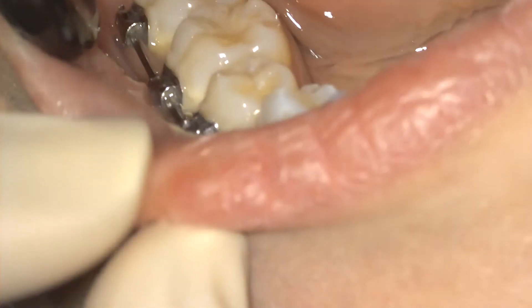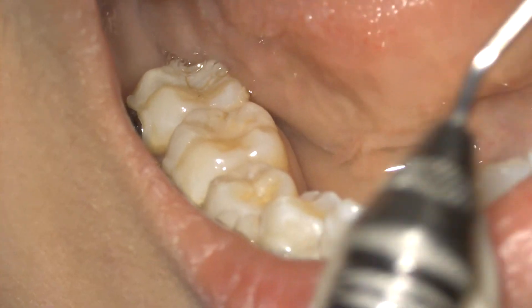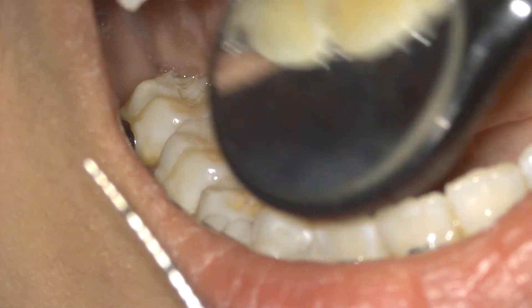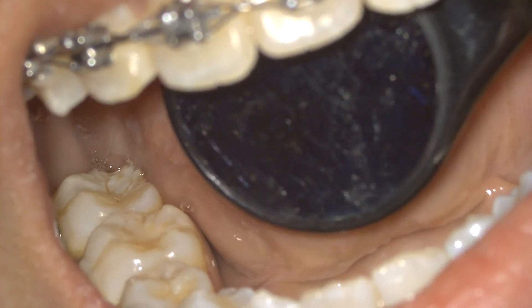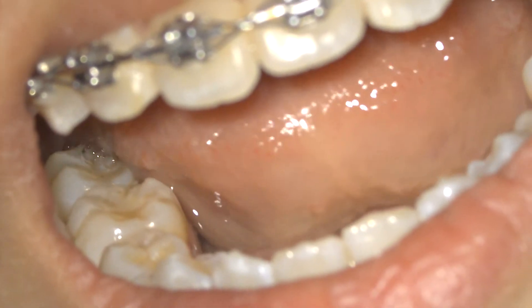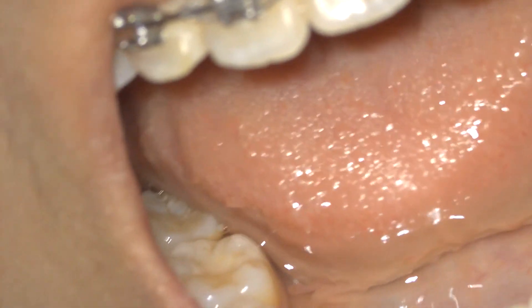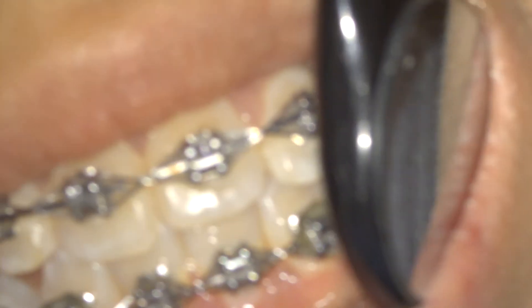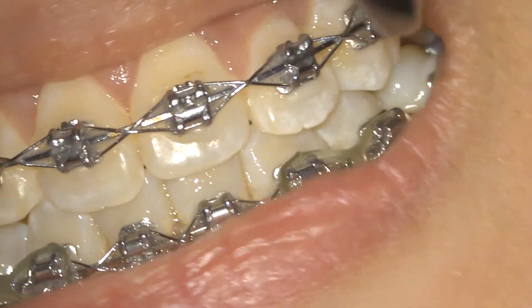Once the calculus scoring is completed on all the teeth, you can record scores — zero, zero, zero here — and also check lingually for the presence of calculus on the upper teeth. Once you finish scoring on all the teeth, I will show you in the video how to calculate and arrive at the oral hygiene status of the patient.